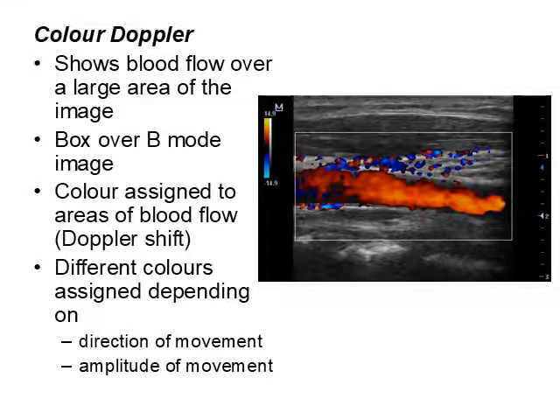So it does give some information about how the blood is moving and the speed as well, but it also lets us show that we do have flow happening. But just always remember, it's flow in relation to the transducer, so where the transducer is standing on the body.